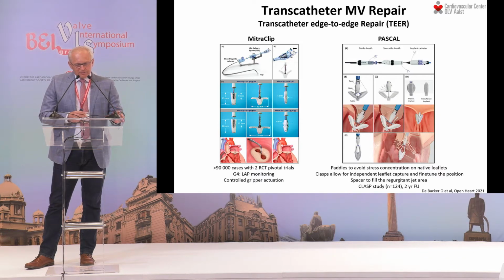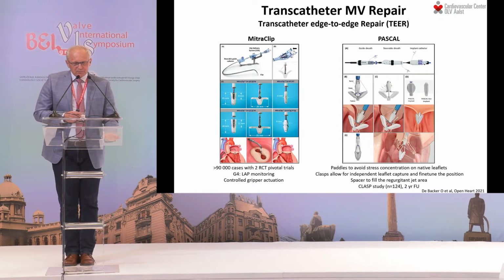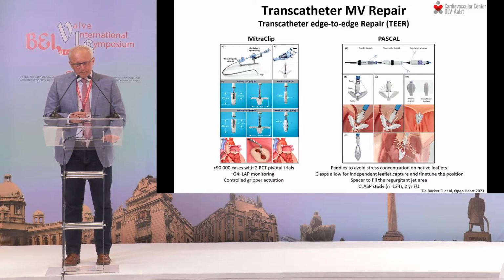The study that was addressing the relevance of the system in clinical practice is called CLASP, with about 124 patients. Recent data were presented at EuroPCR, presenting a 2-year follow-up.